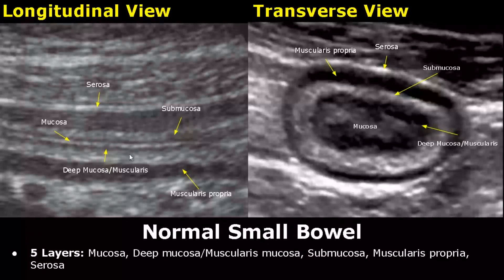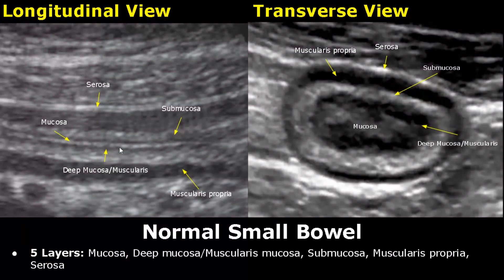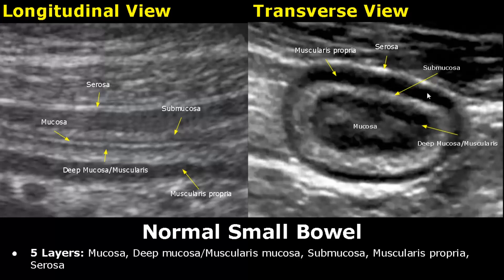The gastrointestinal tract has five distinct layers. The innermost layer is mucosa — it is hyperechoic. The second layer is the deep mucosa or muscularis mucosa — it is hypoechoic. The third, thicker hyperechoic layer is submucosa, and deeper to that is muscularis propria, the fourth layer, which is hypoechoic. And finally, the outermost fifth layer is serosa — it is hyperechoic.